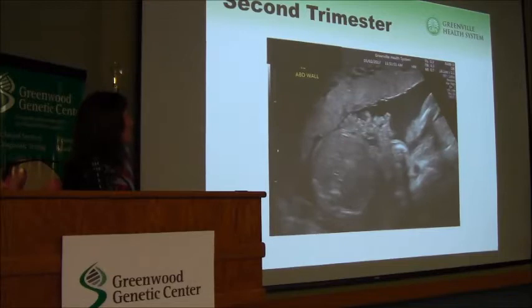And it won't take a lot of time since we're running out of time. Okay. This is a section through the fetal abdomen and cross section, and then there's this stuff floating free, and then gastroschisis, yes. So you're right, we're seeing an uptick in gastroschisis, particularly in young women, less than 20.